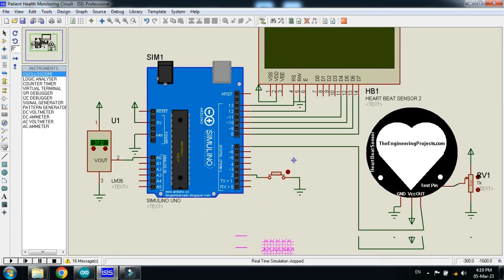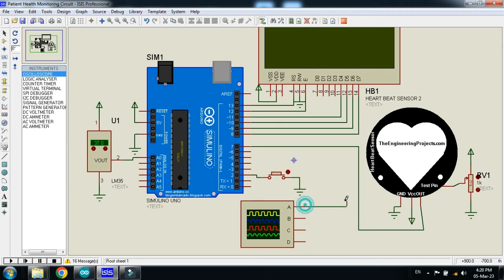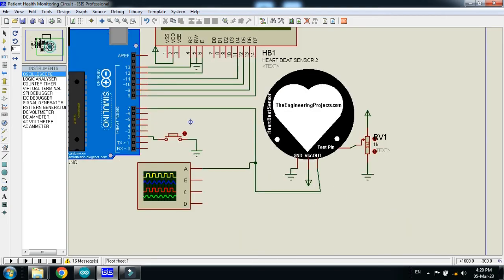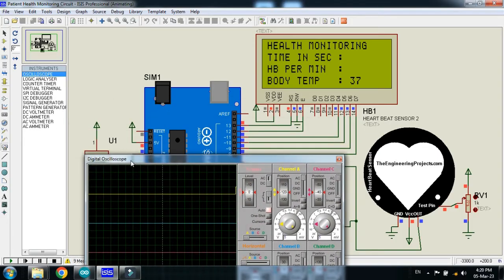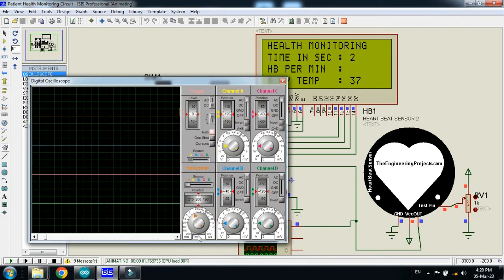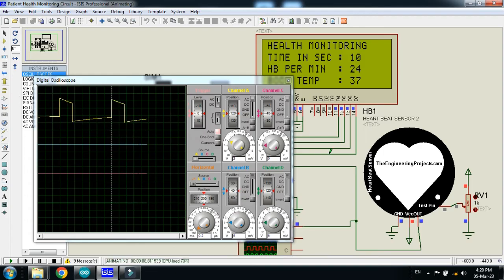Let's place an oscilloscope here and connect it with the heartbeat sensor. Now run it — you can see the waveform. After changing the value of the potentiometer, it will respond accordingly and change the heartbeat. You can see the waveform changing as well.